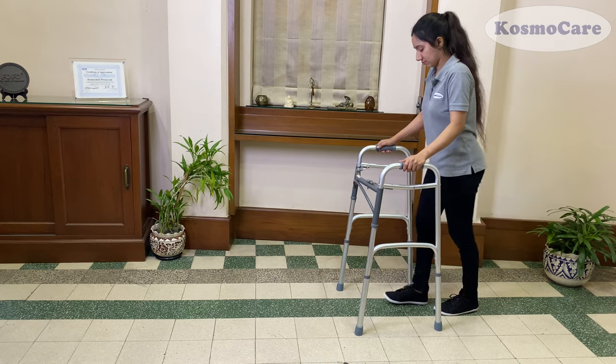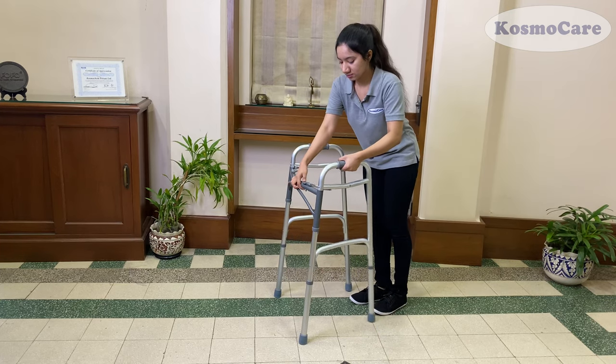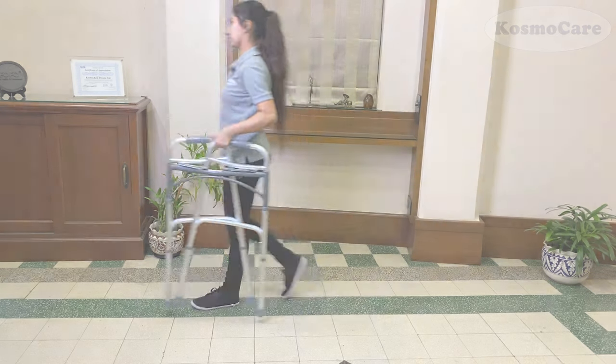So, help your loved ones walk independently and give them the confidence and stability they need wherever they go with the folding walker from Cosmocare.